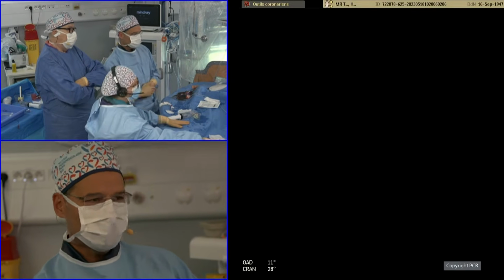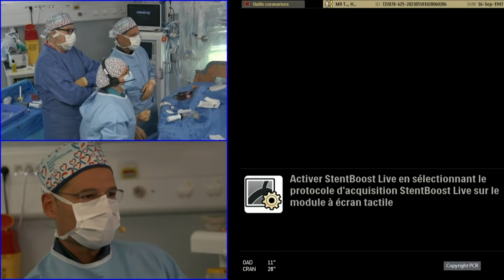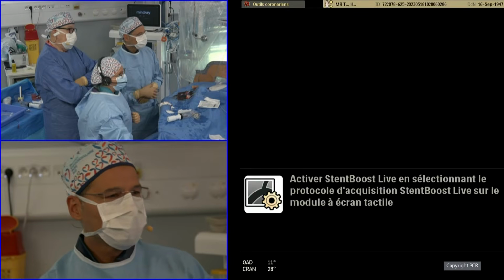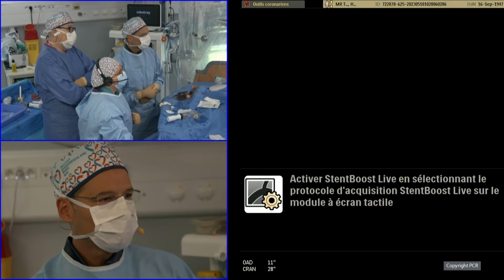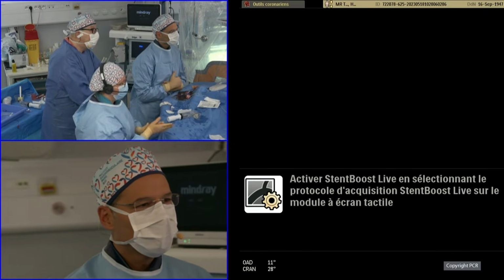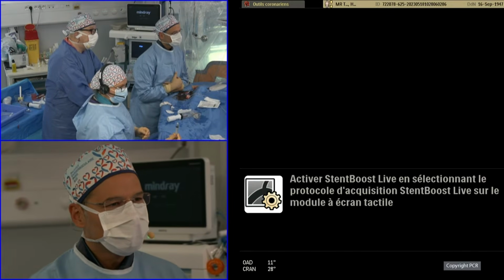And Thierry, we've also been asked how long do you want to inflate the balloon? And I guess that's particularly relevant in the left main, including proximal vessel. I wonder if we could have the hemodynamics up at the point of stent deployment as well. How long will you plan to inflate this balloon?